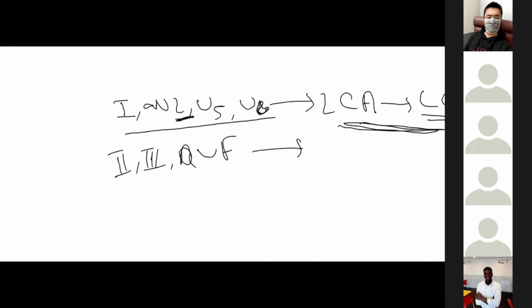right coronary artery. And let's be more precise, the posterior descending branch of the right coronary artery. We have covered lateral, we have covered inferior. Now coming towards the anterior.